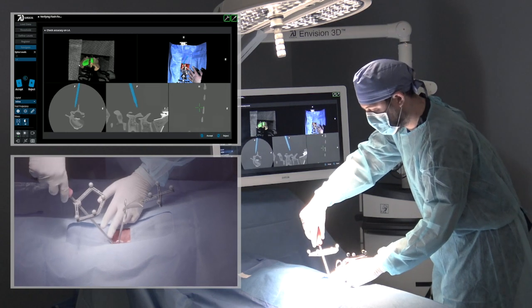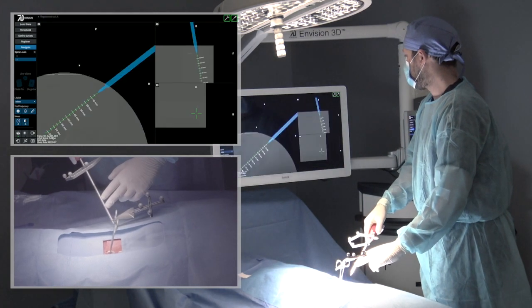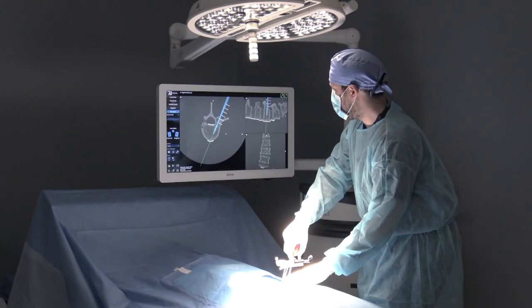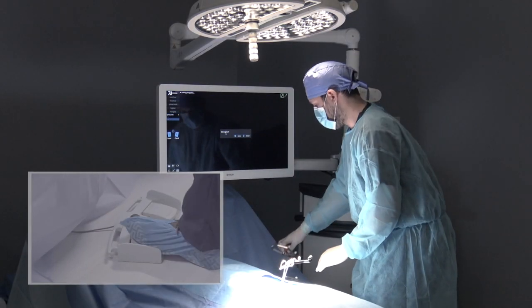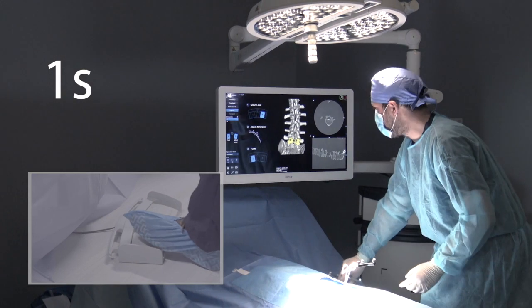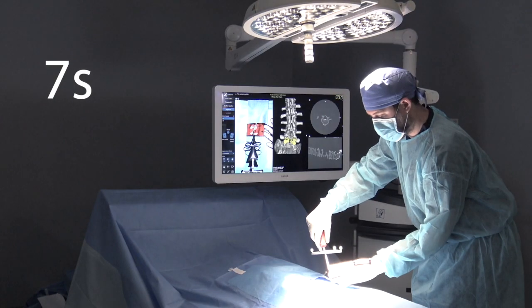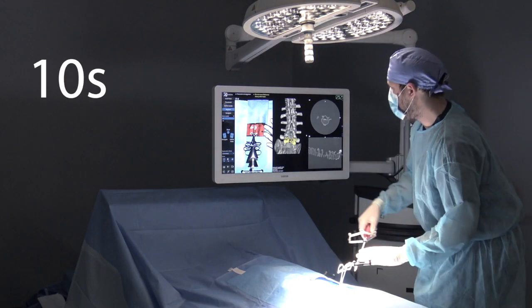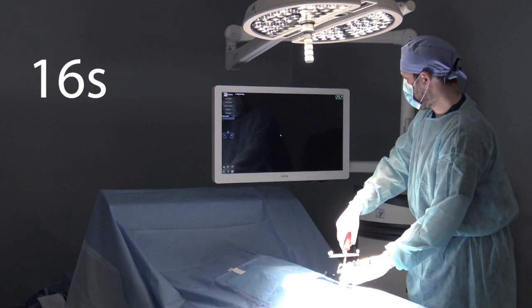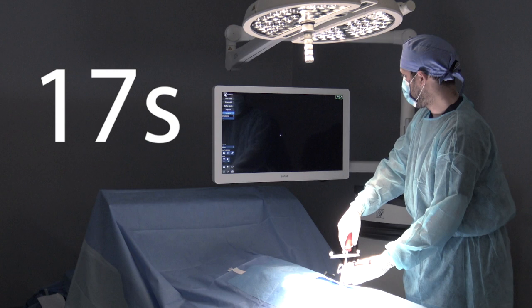Now let's register the next level, L5, in real time without any interruptions. As you will see, the surgeon can control this entire process. In just 17 seconds, the machine vision technology has accurately locked on to the next level of interest without intraoperative radiation or the need for specially trained staff.